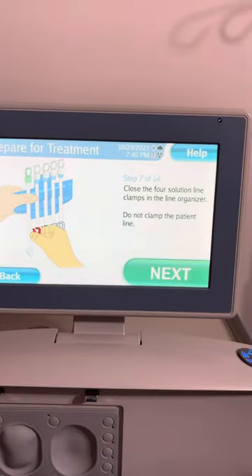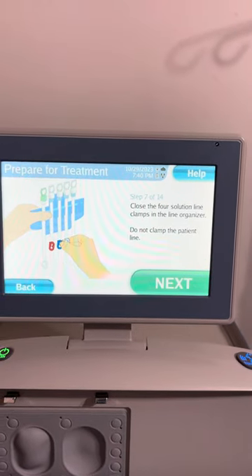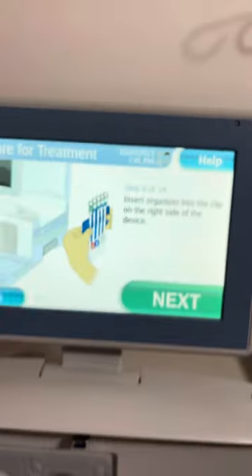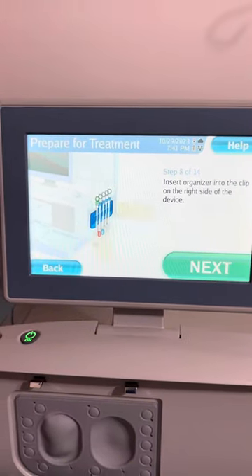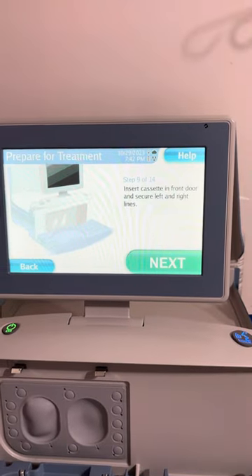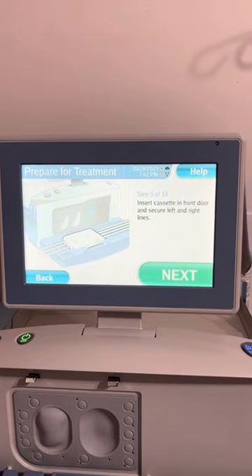Close the four solution line clamps in the line organizer. Do not clamp the patient line. Insert the line organizer in the clip on the right side of the device. Insert cassette in front door, and secure left and right lines.